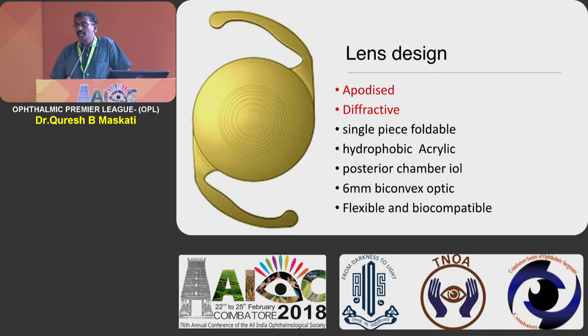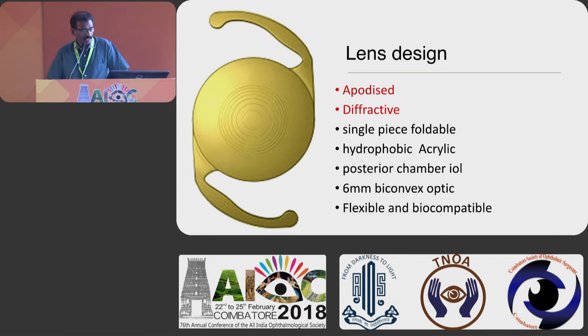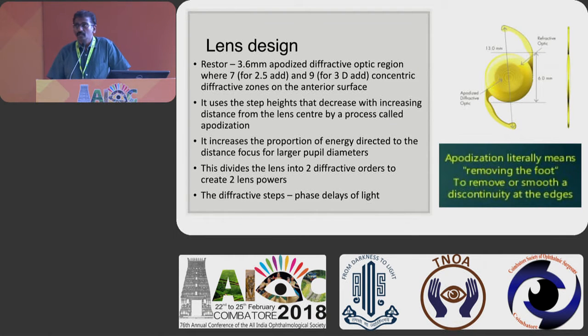Basically it's a new lens design, and the basic lens design we are all aware of is the Acrysof single piece platform, hydrophobic. Being a pediatric ophthalmologist myself, I prefer this Acrysof lens in my pediatric cataracts. And what is this apodization technology? Rather than having different zones, which add to the photic phenomena, we are removing the steps. The central ridge is larger, and as it blends down to the periphery, it becomes thinner. So the light distribution is a bit more uniform, to minimize the contrast loss and the photic phenomena.